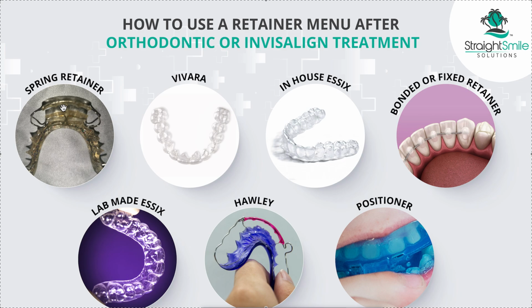There is an upgrade fee for the spring retainer, depending on the complexity of the design, customization, and artwork. I don't think most patients are going to pick this. It's very, very rare, but very occasionally they will, so it's a good idea to put it there. Same wear as the Hawley.